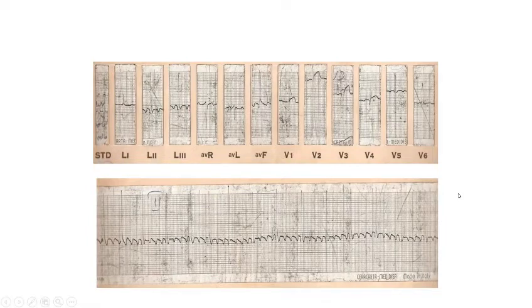This is not very difficult. Some standard arrhythmias. Flutter waves are there. Atrial flutter, yes. Typical flutter, atypical flutter, and what is the difference?